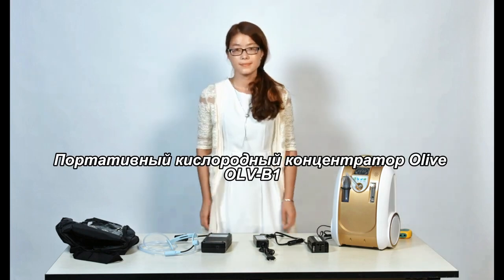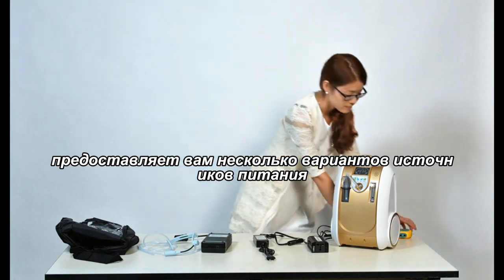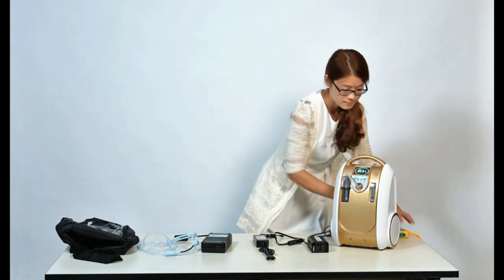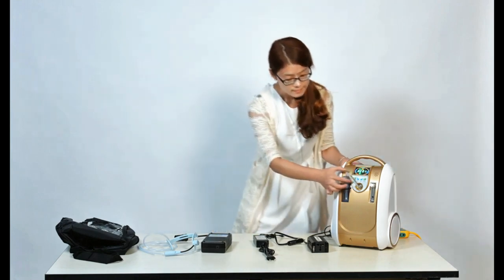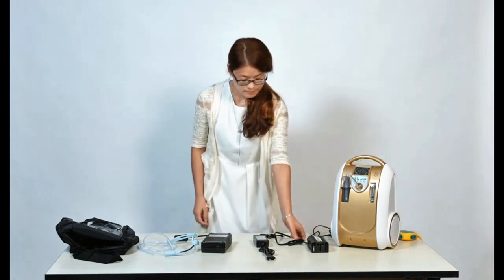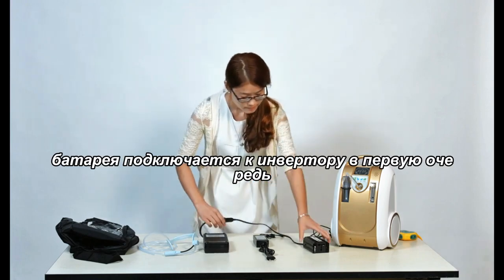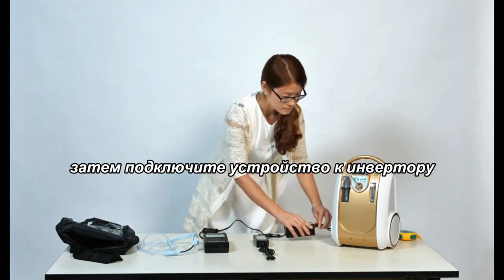The Olive O-AirVB1 portable oxygen concentrator provides you with several power source options. AC power: plug into the wall outlet directly. DC power inverter: connect with your car cigarette lighter. Power inverter: connect with the power inverter first, then connect the unit with the power inverter.